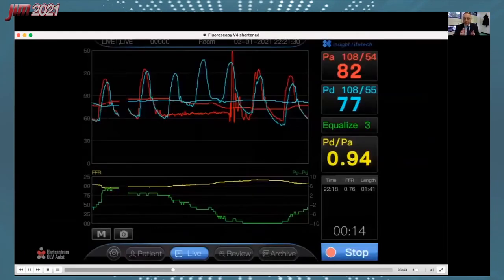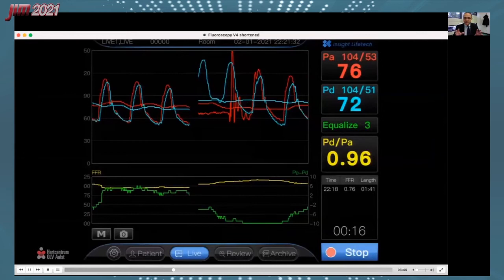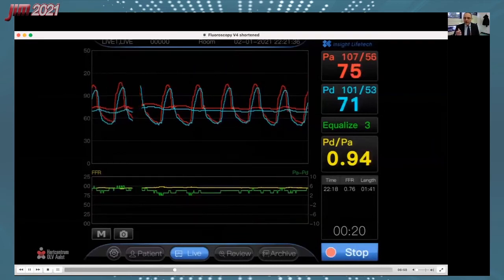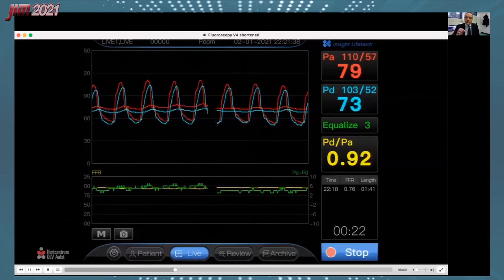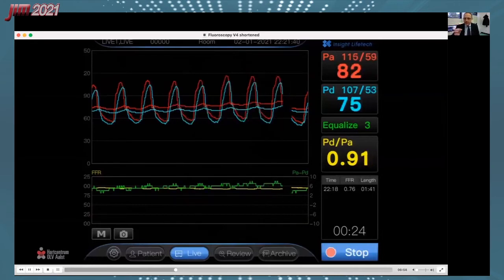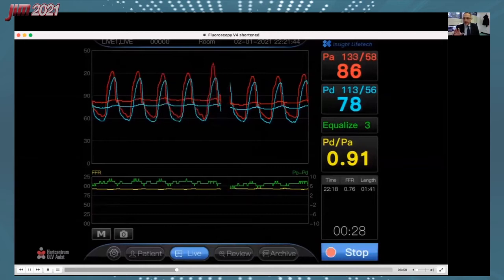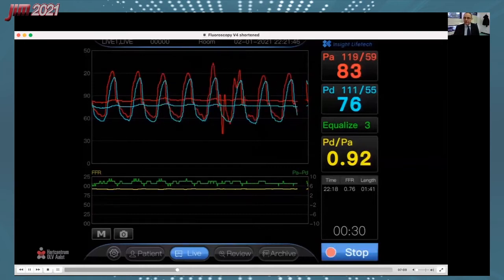You see, that's the advantage of combining microcatheter with papaverine, because we don't have to use contrast again when navigating the pressure wire within the coronary artery. The guide wire is there. All we have to do is push the microcatheter distal. This is the FFR.